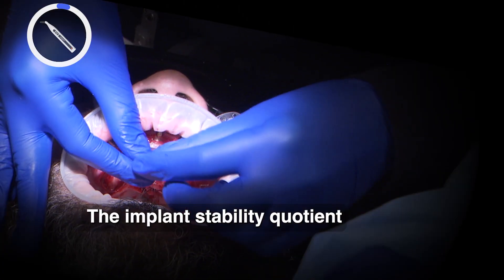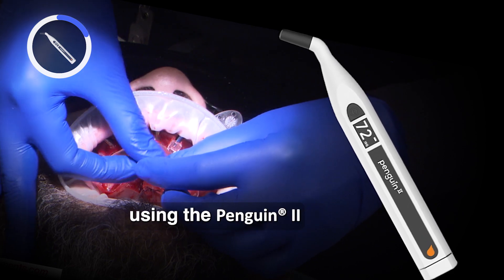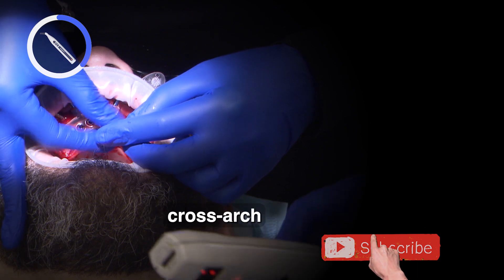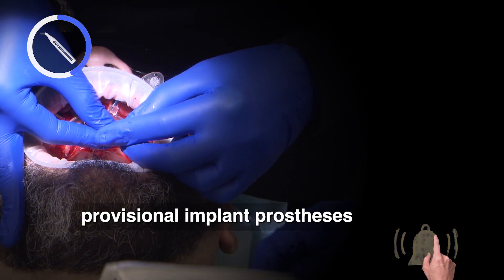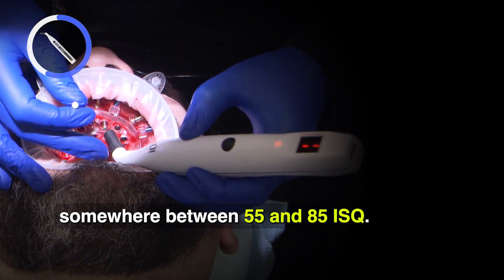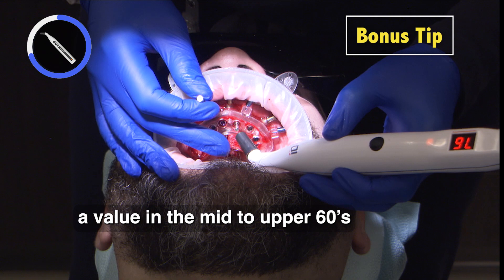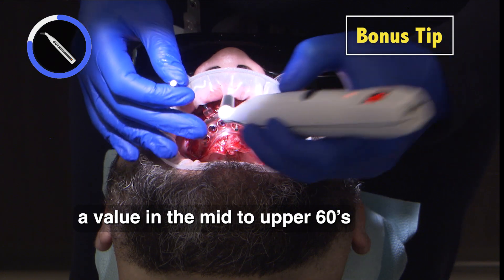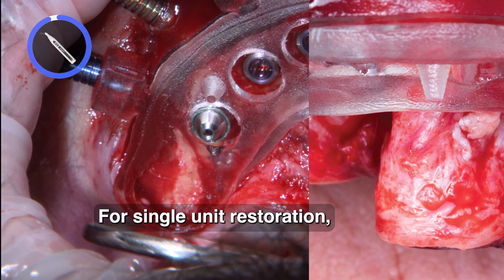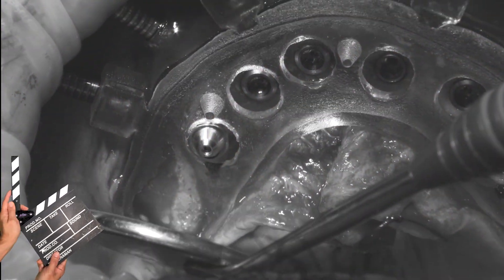The implant stability quotient, or ISQ value, was calculated using the Penguin II Osteointegration Monitor. The acceptable stability range for cross-arch immediate loading with a provisional implant prosthesis is a measurement somewhere between 55 and 85. Ideally, I prefer to achieve at least a value in the mid to upper 60s when immediate loading cross-arch implant restorations. For single unit restorations, I do not load a restoration lower than a value of 70.